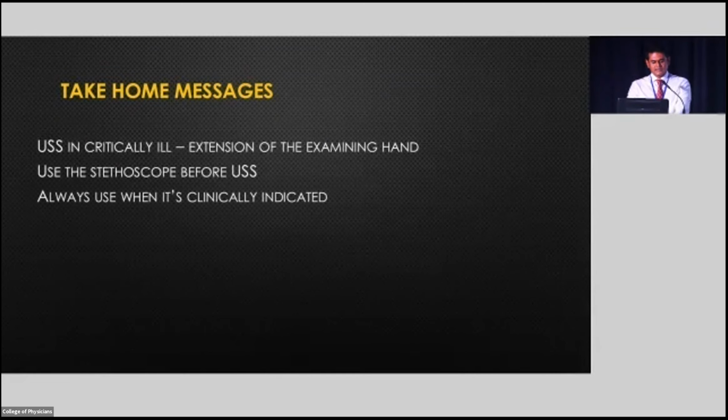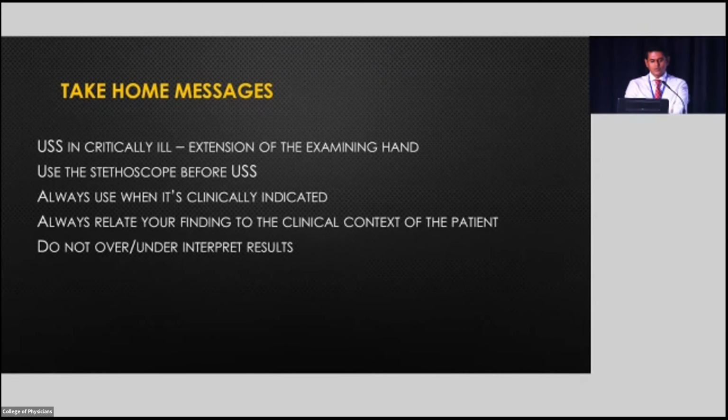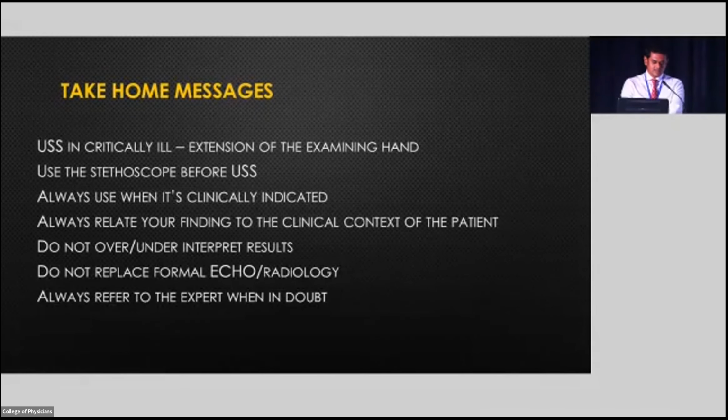Always use it when it's clinically indicated. Don't just go and scan everyone. Always relate your findings to the clinical context of the patient. Do not over- or under-interpret results. And do not replace formal echocardiography or radiology, because this is point-of-care ultrasonography. Always refer to the expert when you are in doubt, because making a decision on a doubtful finding is not appropriate.